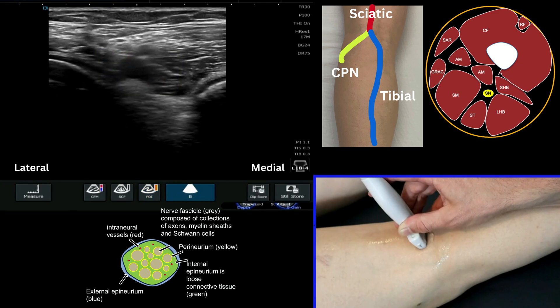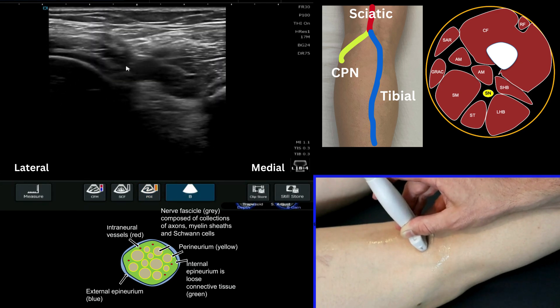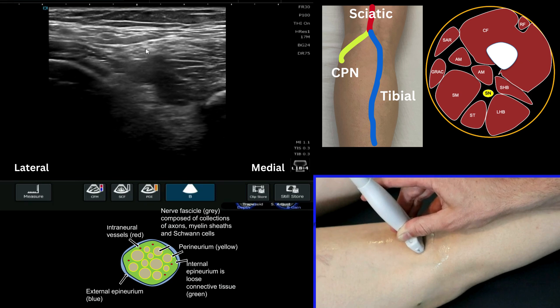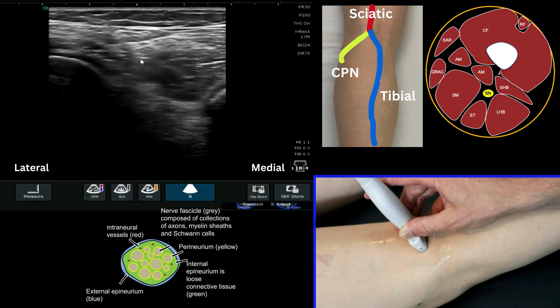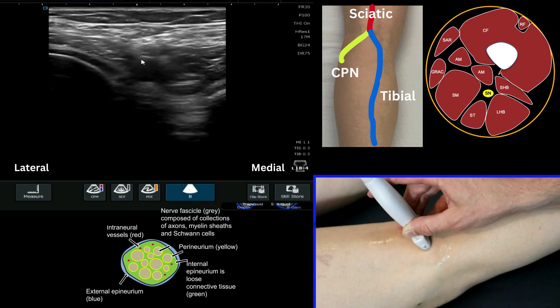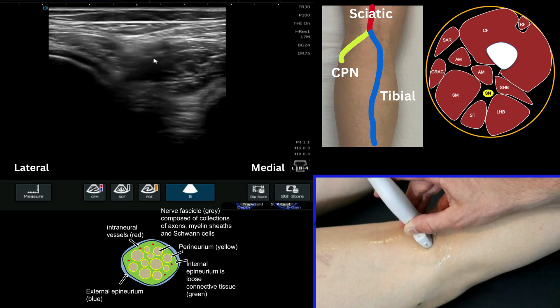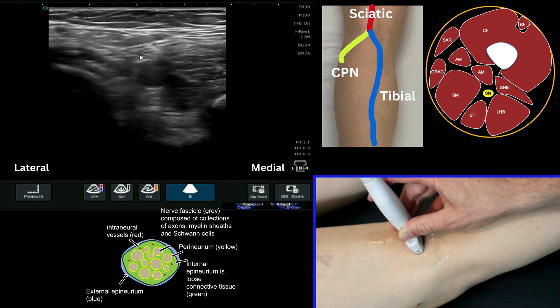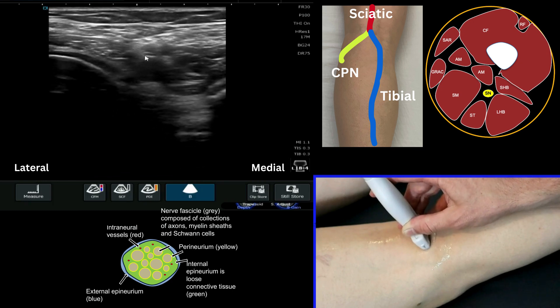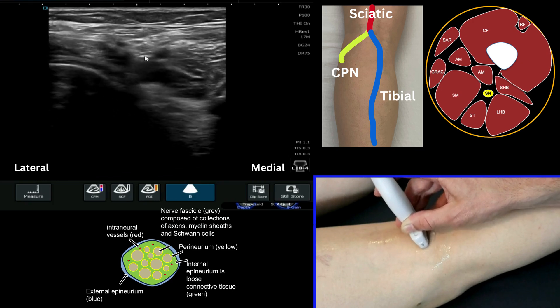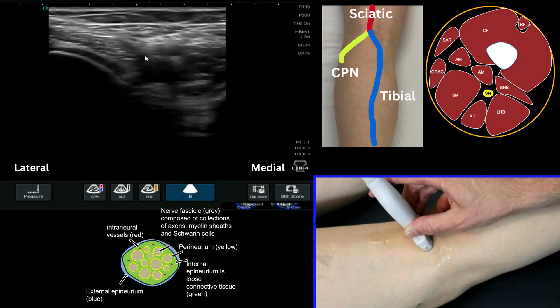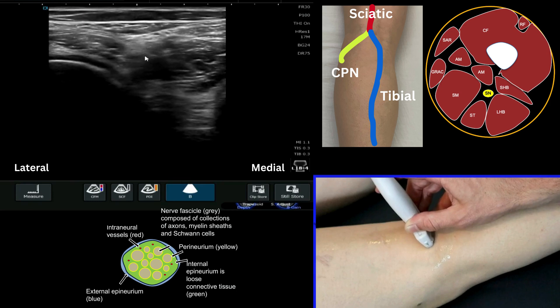If we now look immediately superficial to that, we'll start to see that classical appearance of nerve — that honeycomb or pepper pot appearance directly superficial to the artery. At this point the sciatic nerve has actually already bifurcated into the tibial and common peroneal nerves.